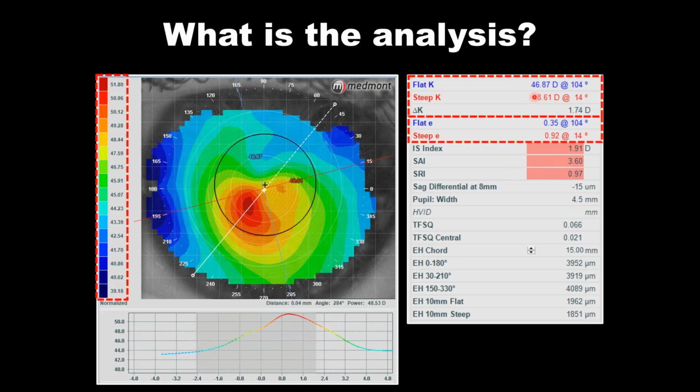When we look at the eccentricity value, we said that a normal E value is about 0.65, and this cornea is indicating a 0.92 E value. Looking at hundreds of keratoconic patients, they typically show eccentricities over 0.8 E value, and certainly this patient is over that threshold of 0.8. What else? We go to the disease detection indices, all lit up in red. So that's a definite indicator that this patient is above the threshold in all of the disease detection indices.